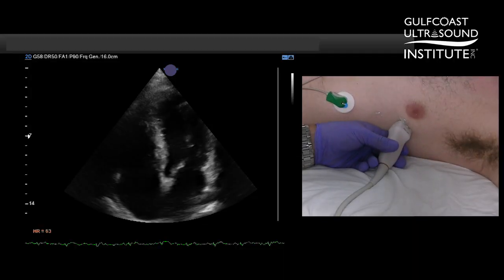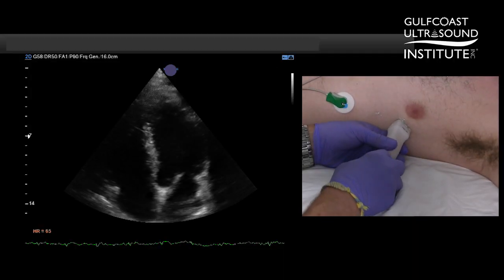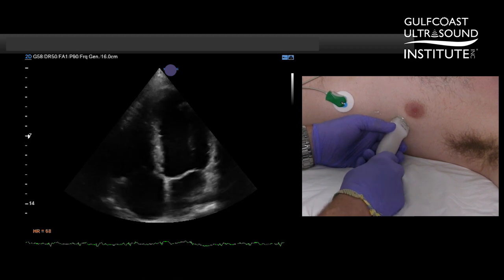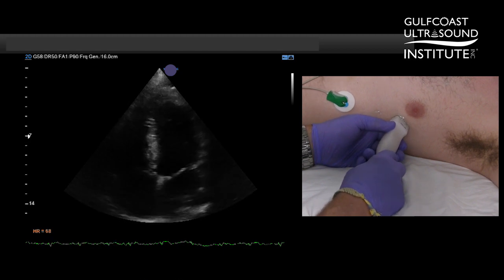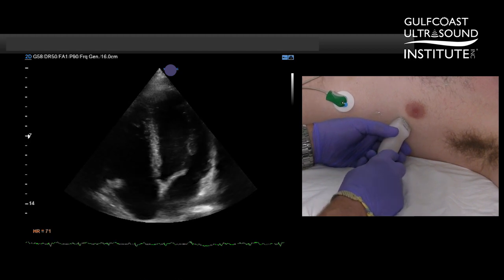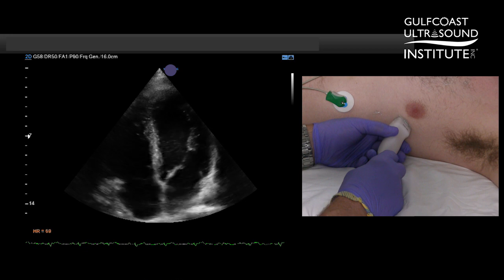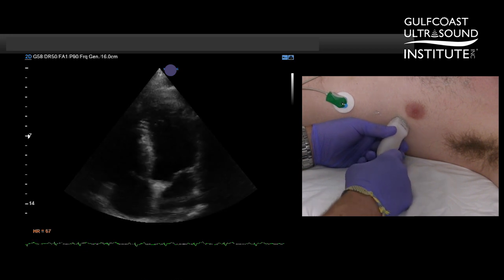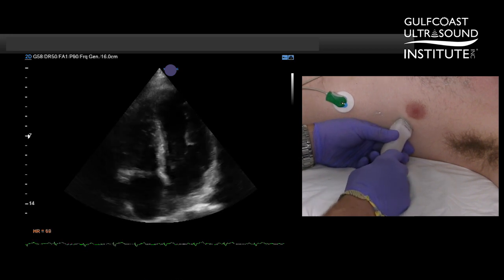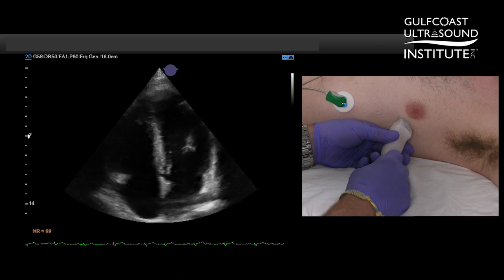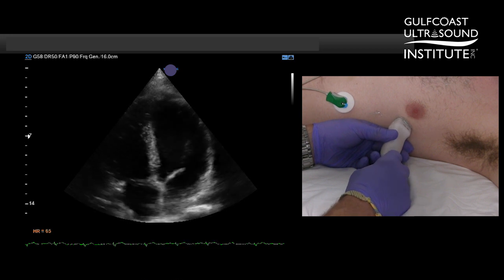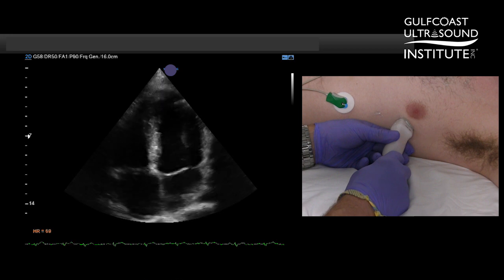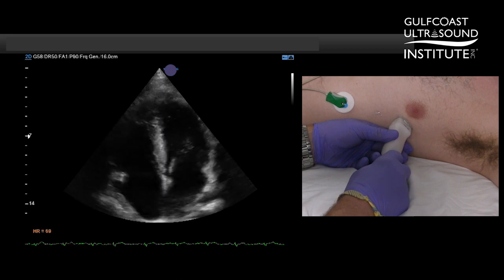Normal traditional views when we look at the apical four chamber are typically focused on the left ventricle. The purpose of the RV focused view is to give a better representation of the true size, but it also makes the RV the primary focus for measurements and quantification of RV function.